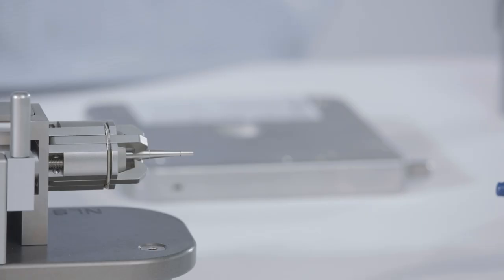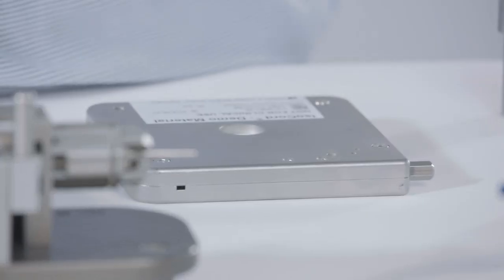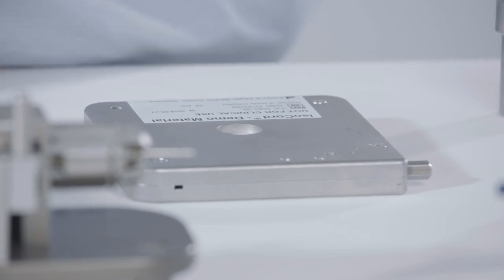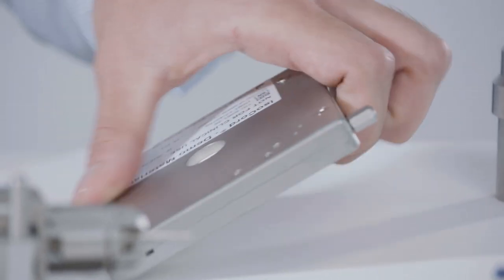Isocord is a seed chain consisting of iodine seeds and spacers embedded in a biodegradable suture. The seed chain is supplied in an isocord magazine which can store up to 70 seeds.